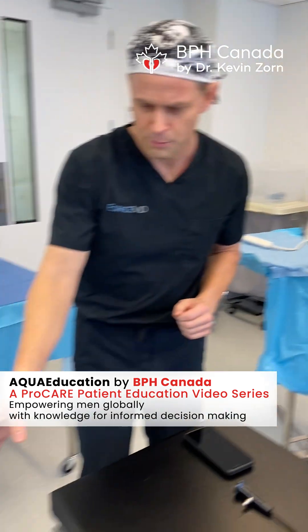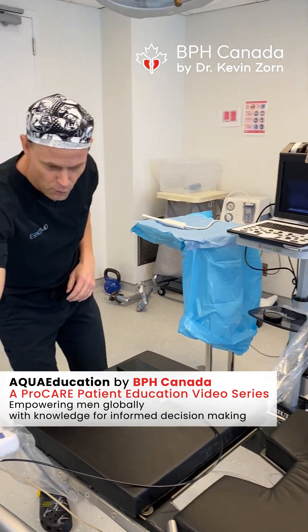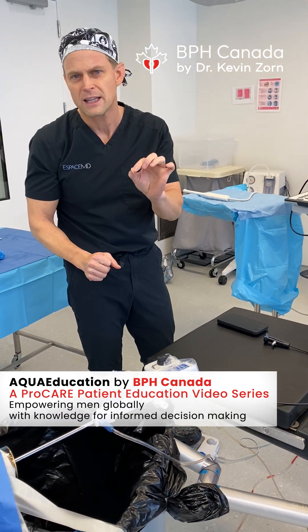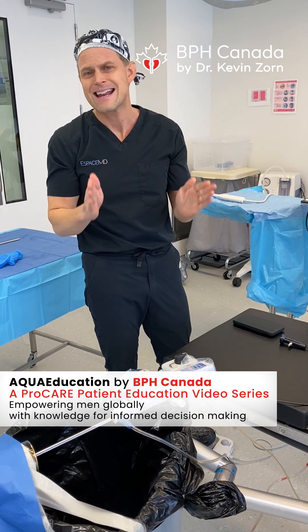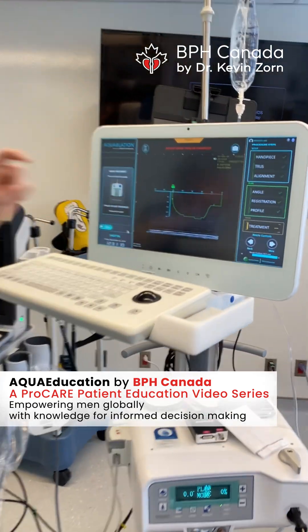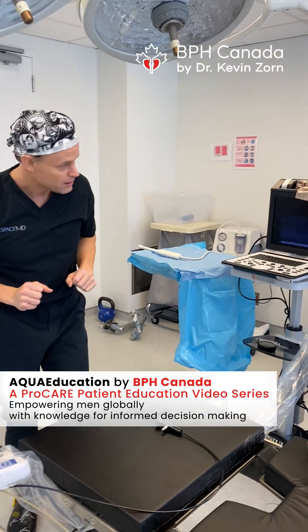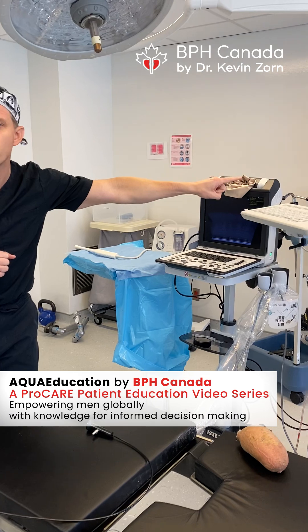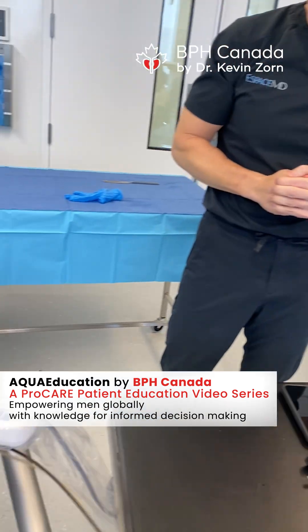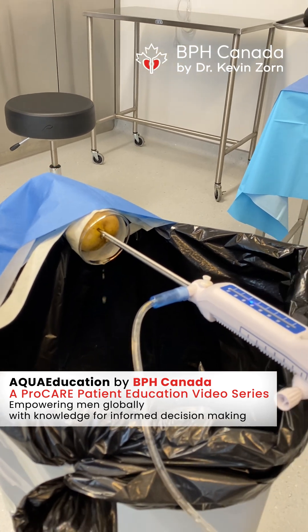So here we go. We're going to activate — we'll press our plus button — which will allow the motor to drive forward a very thin tube with a sapphire crystal opening at the end. With that, water will be coming out at over 8,000 PSI to obliterate tissue as deep as 2.4 centimeters. You can think of that as a radius — that's how wide this prostate will be opened. We'll see here, in four minutes. So we can treat prostates of any size, not in hours but in minutes. This is the device — there's no movement sitting in place in line with the urethra.